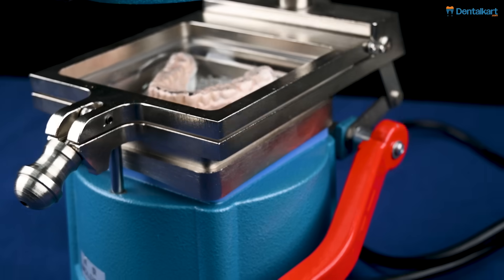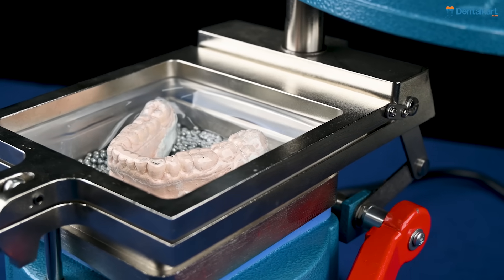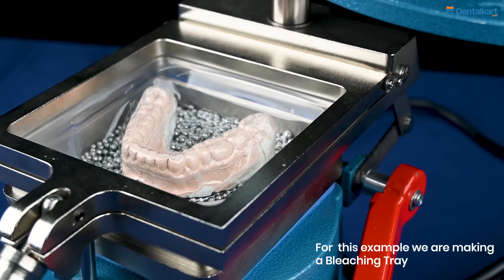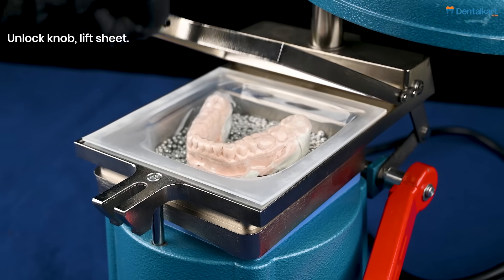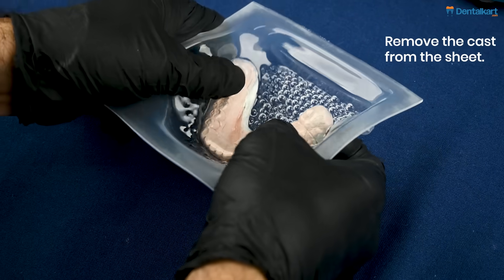Wait for the right time to pass before removing the sheet and cast together. Once ready, unwind the knob. Remove the sheet and the cast, then separate the two.